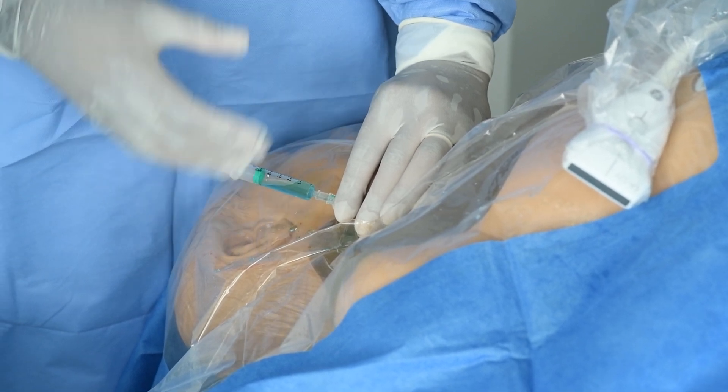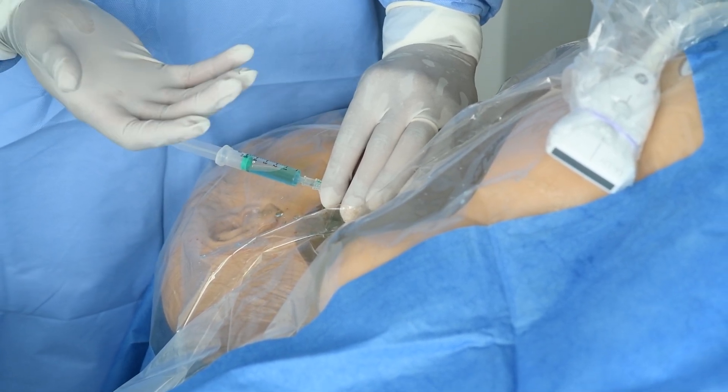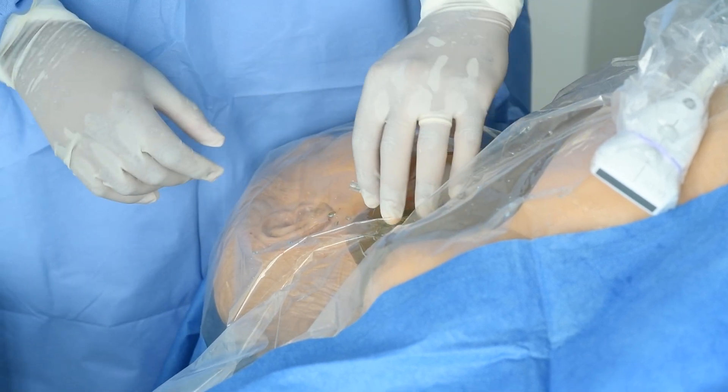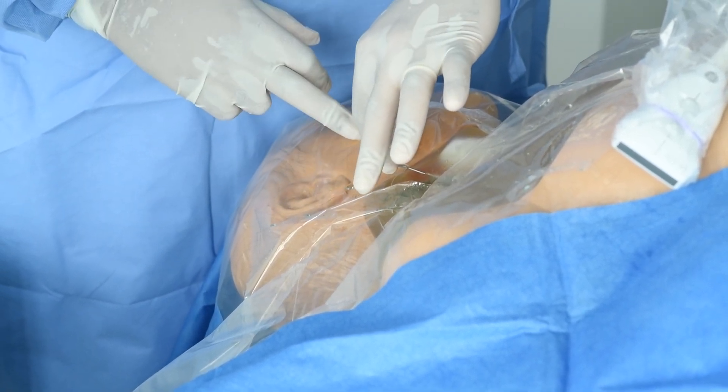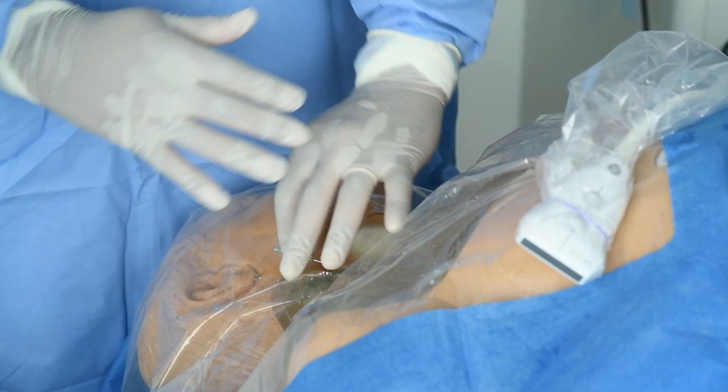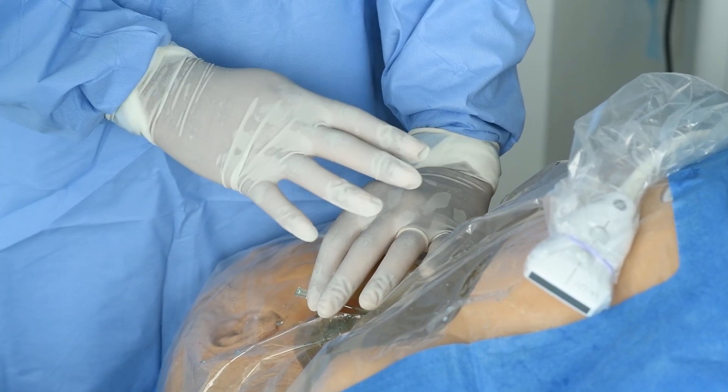You can see here I can still aspirate with the needle in, so that hasn't moved. Then after that you're obviously going to disconnect your needle. Don't do this — I see a lot of people doing this — holding it with their thumb and index finger correctly, but then there's no other attachment of their hand to something that's attached to the patient solid.